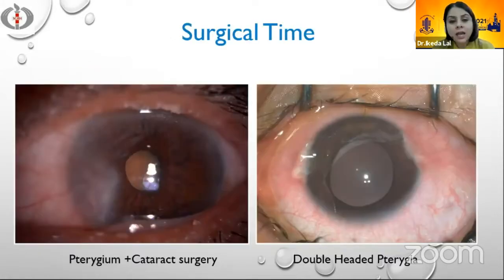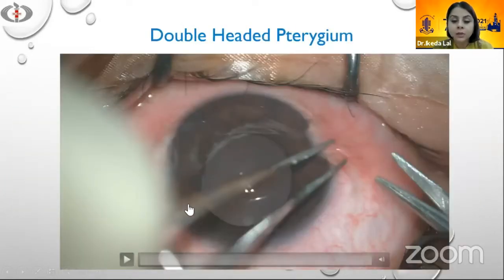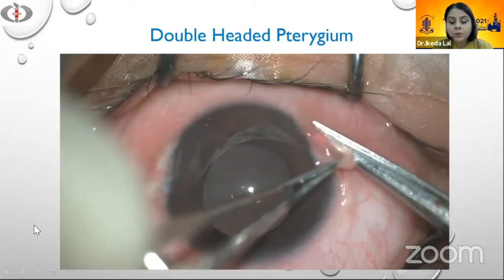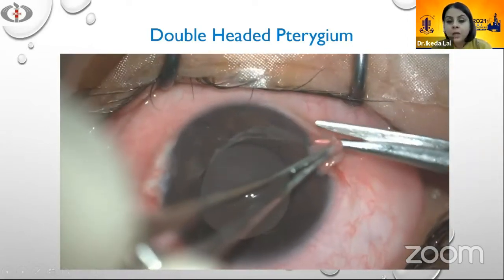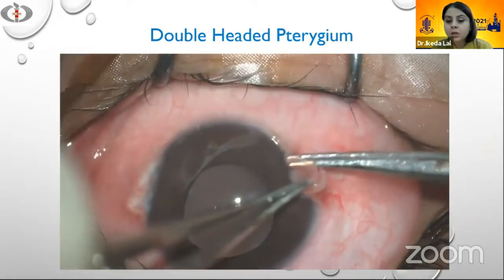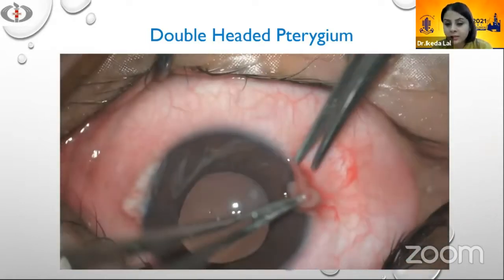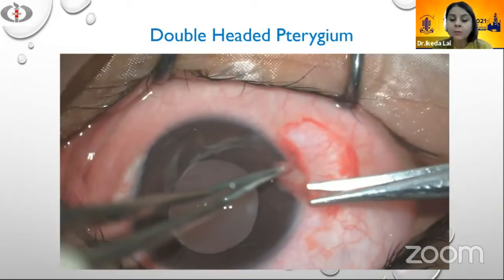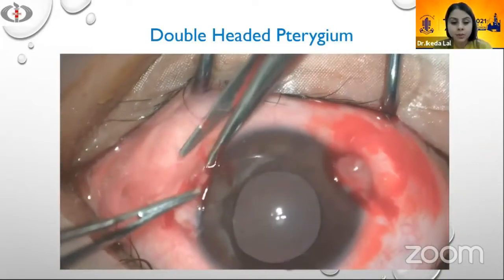Now, the surgical time especially becomes important in patients like these. We can see that this is a patient with pterygium and a very hard mature cataract, and this patient has a double-headed pterygium. So in these patients, we do not want to have a great amount of surgical time. So just to quickly run over this video of a double-headed pterygium. Again, what I'm doing here is excising this tissue at the neck and making sure that the head is freed up at both the nasal as well as the temporal side.